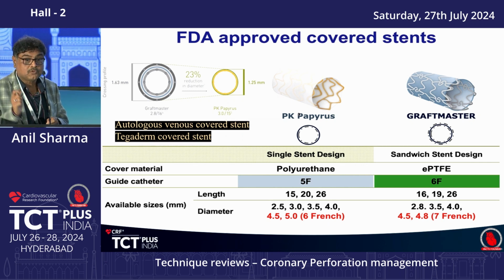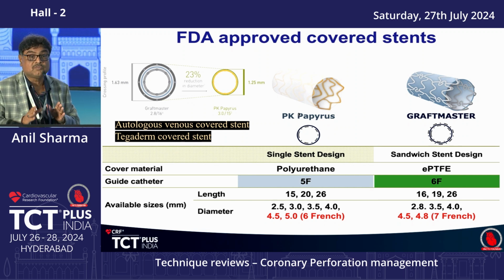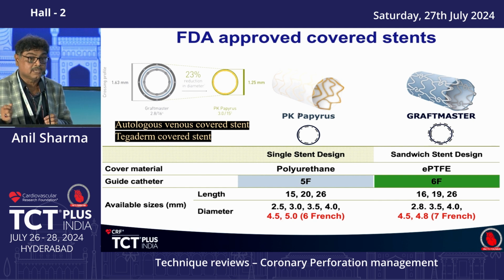Other thing is that before putting protamine, that is the last thing, you should always be very clear that all the devices, nothing is there in the coronary except the guide, nothing should be in the system, because thrombosis then can be the double-edged thing. An important thing is there, even if perforation, like this was a big perforation, but the moment pressure came out, I was relaxed. It is a question of 1 hour, 2 hour, 3 hour, so nothing to worry.